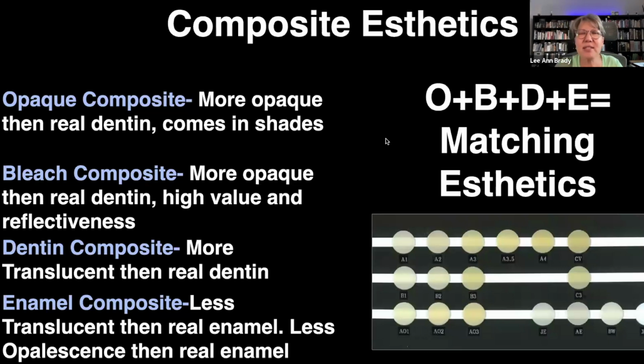And that's true. That may sound like it never happens, but it does happen. There are some natural teeth that are fairly simplistic in their aesthetics that can be really well matched with just one tube of composite, especially if you've done a really nice bevel or blending zone and you get that infinity margin. And then on the other hand, there are teeth that are exceptionally complex in their aesthetics. And you might actually need four layers, one from all of these different categories.